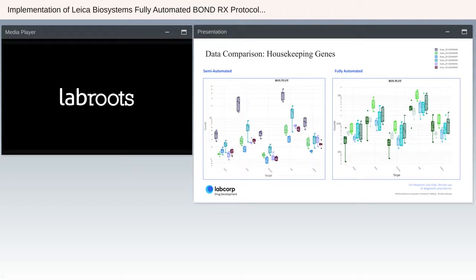And I think the reasoning for this is exactly the same as we saw with the background. We're just having a more consistent and more reproducible assay environment that allows us to really increase the integrity of the data. So I think this was, we're seeing the same trends, so we don't think this is anything that is biologically insignificant. It still makes sense in the context of the story. It just makes for a better story because we're getting so many more counts and so much more data above the threshold for the housekeeping genes. So this was really exciting as well.